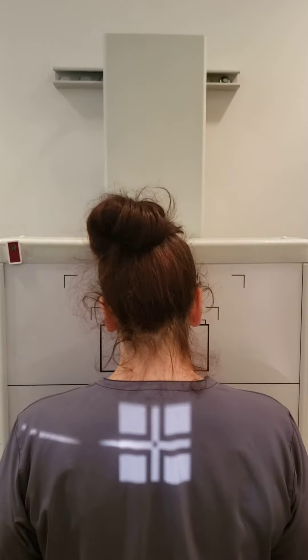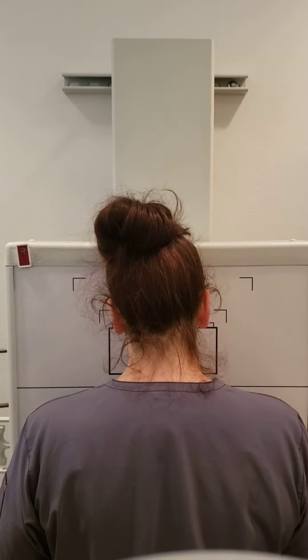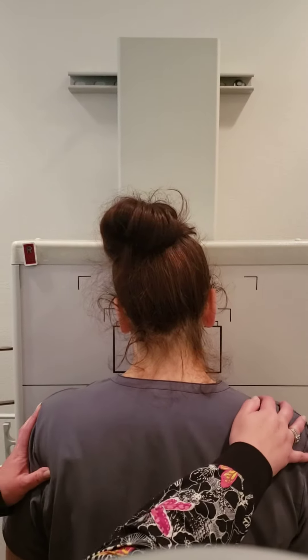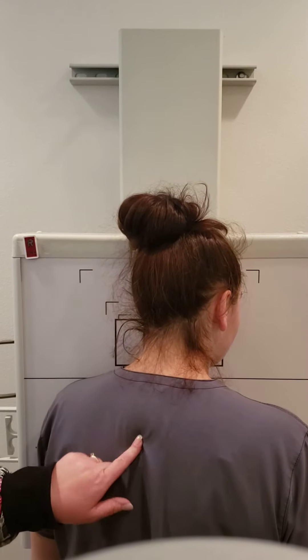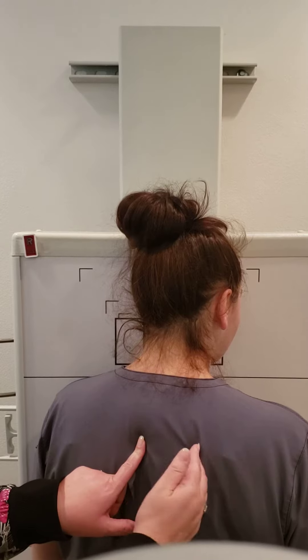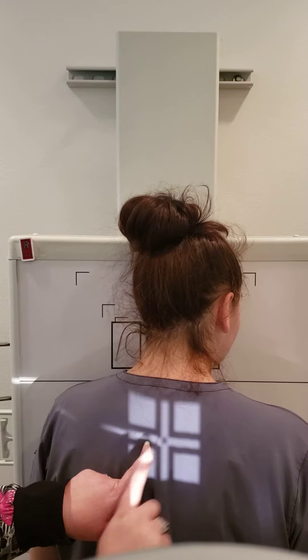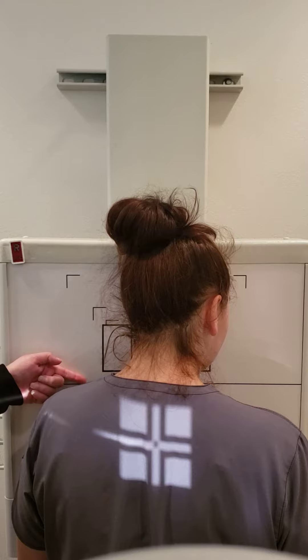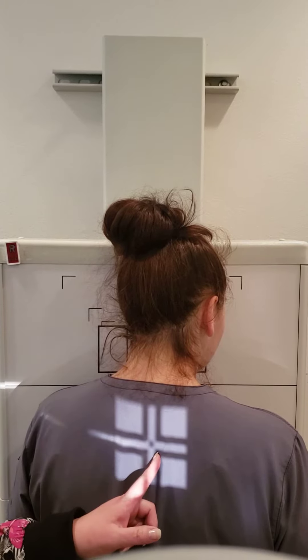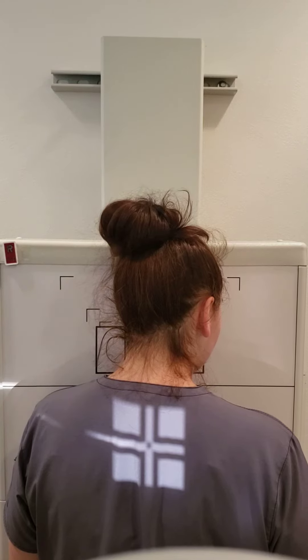Then we're going to do our first oblique. Since I've already got a left marker on here, we'll do the LAO first. So we're going to roll her into a 15 degree LAO. I'm going to find the spine and center about one to two inches to the lateral portion of the spine. We're going to position to the upside, but we're visualizing the downside. So while we're positioning to the right side, we're looking at the left sternoclavicular joint. We have our shielding here and we're ready to align.